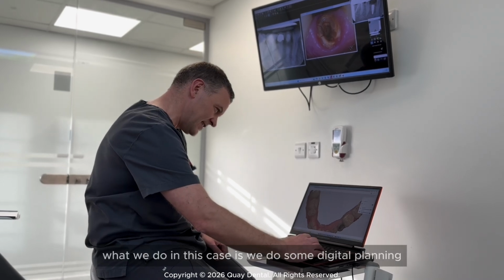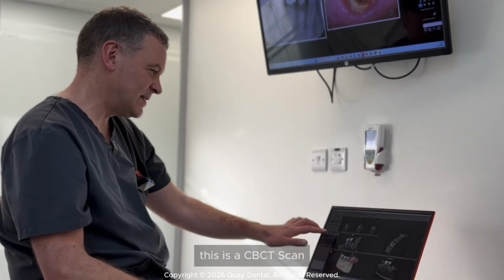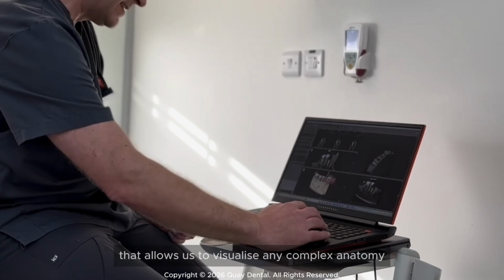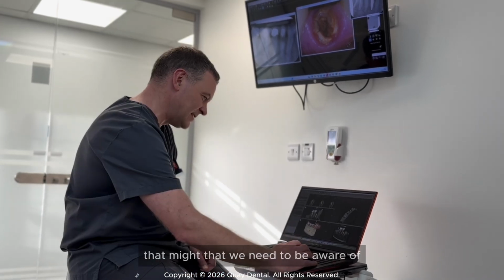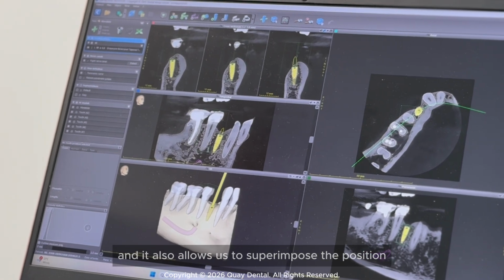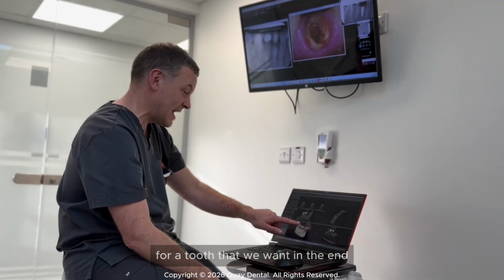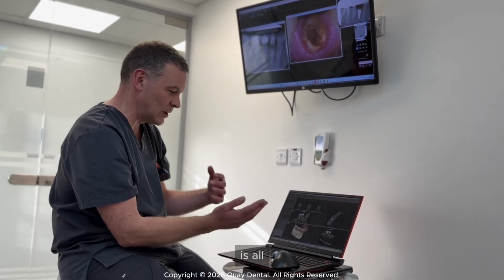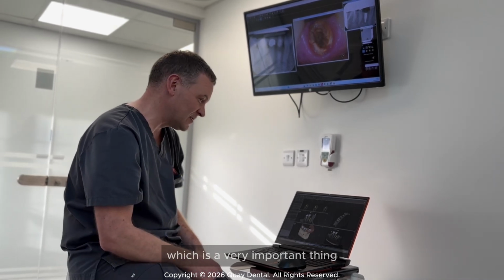So what we do in this case is we do some digital planning. This is where we get a 3D x-ray. This is a CBCT scan, and this allows us to do a number of things. It allows us to visualize any complex anatomy that we need to be aware of in doing these delicate procedures. And it also allows us to superimpose the perfect position for a tooth that we want in the end. It's what we call prosthetically driven. So the way that we plan the implant is all planned around where we want that final tooth position to be, which is a very important thing.